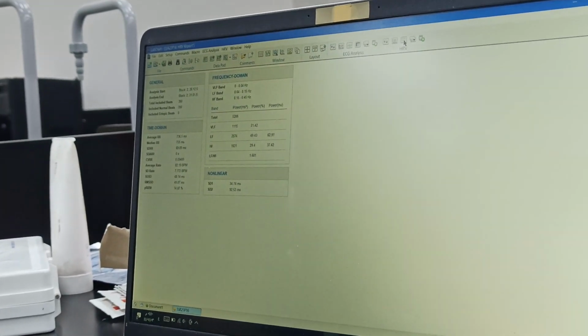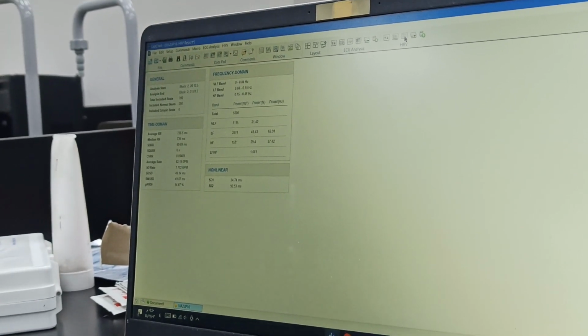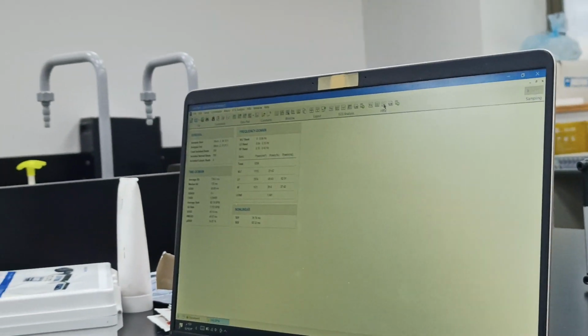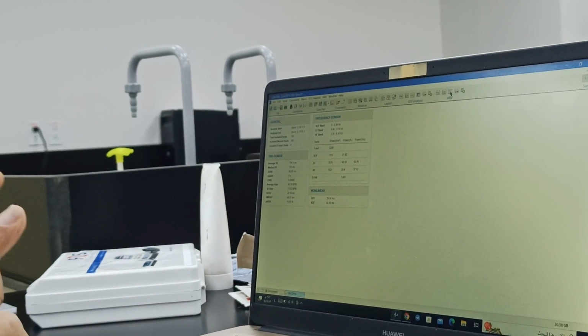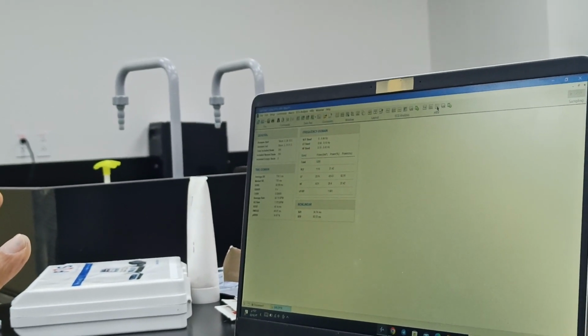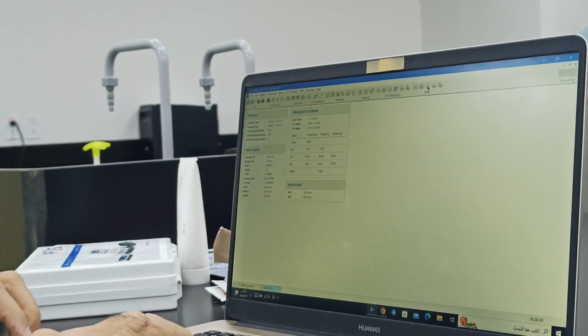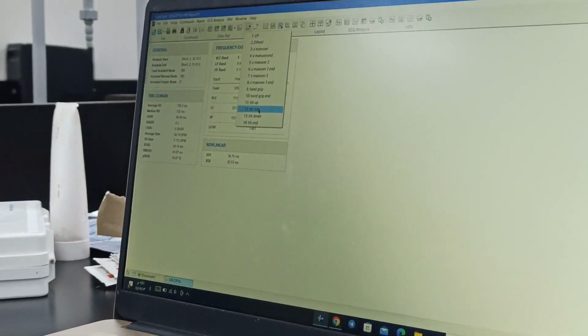But we can start with the participant and do all the work and get all the data without understanding these for now, at least. Yes, no problem. But the important thing was that you understand how important it is to get a proper ECG before embarking upon others. Yes. Okay. So add to data pad and then go to actual tilt.